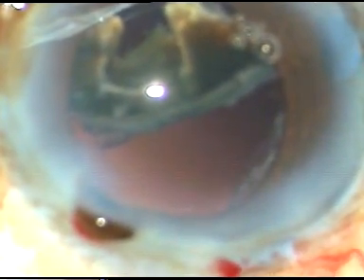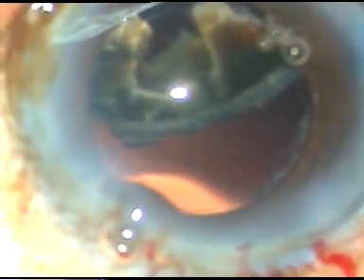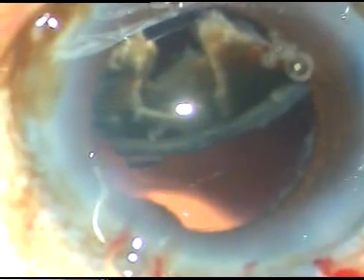I am going slow because this is the last nuclear fragment. I had to come out because of nuclear prolapse — I wanted to inject some viscoelastic substance to push the posterior capsule back. The iris prolapsed through the side port; I just reposited the iris. And now I have to go again into the eye.